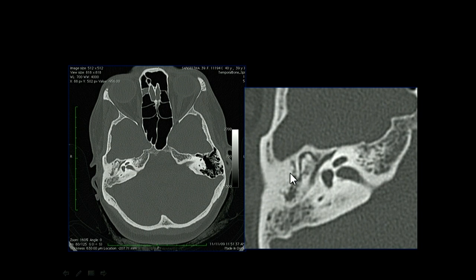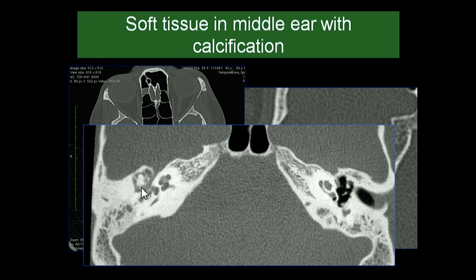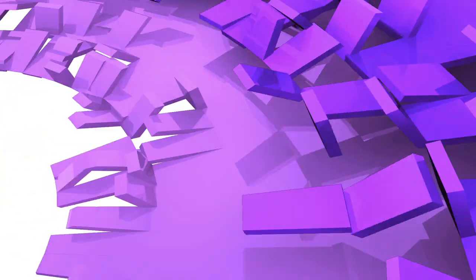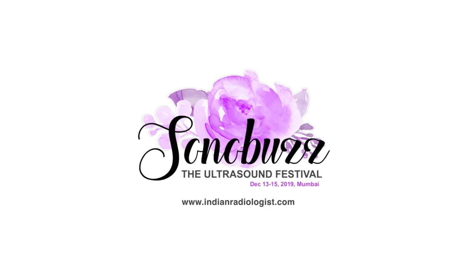A different patient with long-standing ear discharge shows small bony spicules surrounding the ossicles. This is long-standing disease with soft tissue in the middle ear and calcification — this is tympanosclerosis.